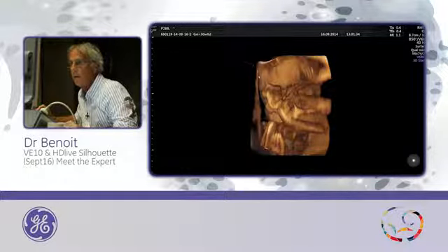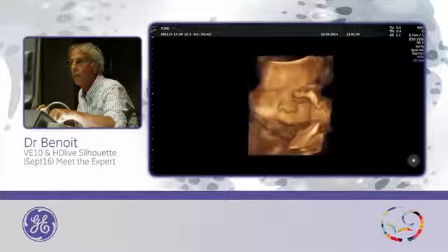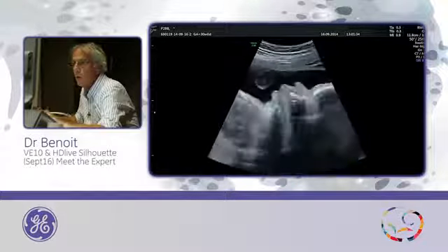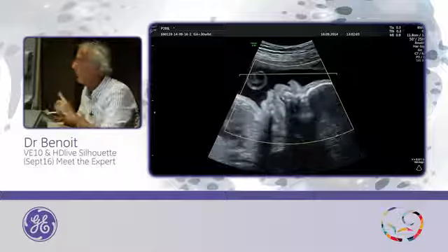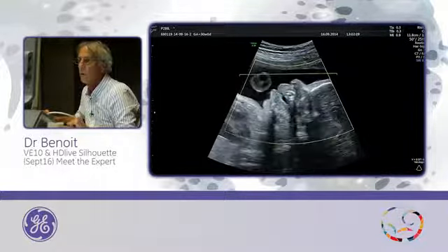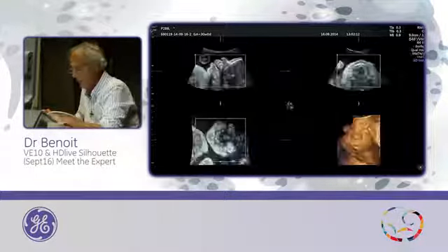Yes, I will do it. First, I will use a magic cut. Okay. And there is, you can do, yeah. So, yes, I will use 4D later because it's nice when the baby is moving. So I do it again, static 3D on the face.